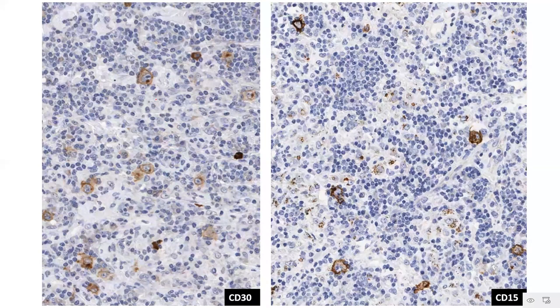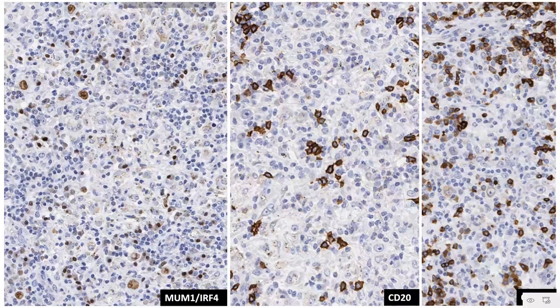When you do CD30, you see that some of these cells express the membrane as well as the paranuclear Golgi zone pattern of positivity, and likewise in the case of CD15. So the cells express CD30 as well as CD15. The post-germinal marker MUM1 IRF4 is also seen to be expressed in some of these atypical large cells. CD20, like I already said, was not expressed in these large cells, and also the nuclear transcription factors like OCT2, BOB1 also are not expressed.